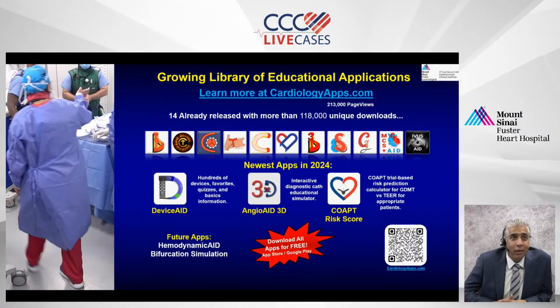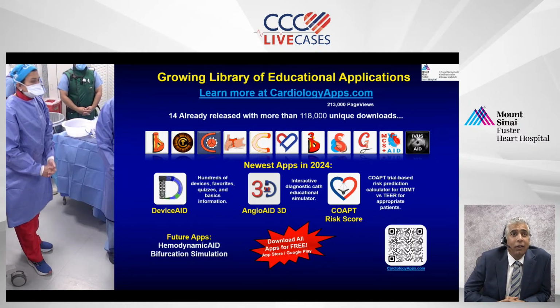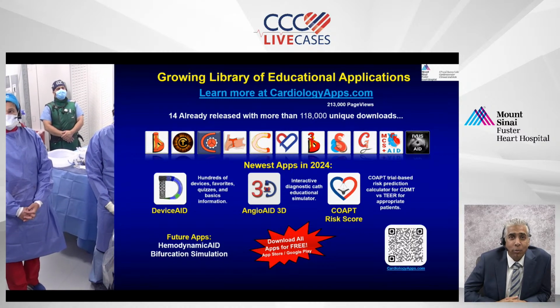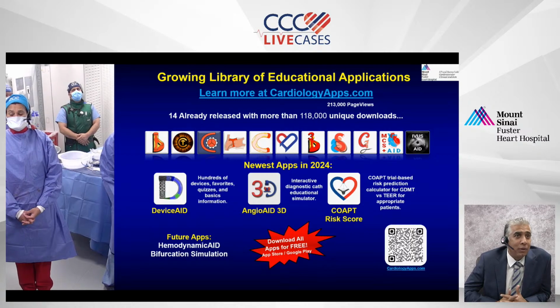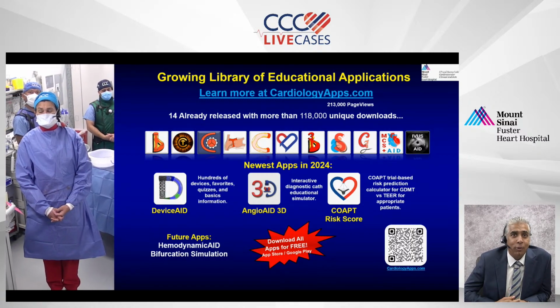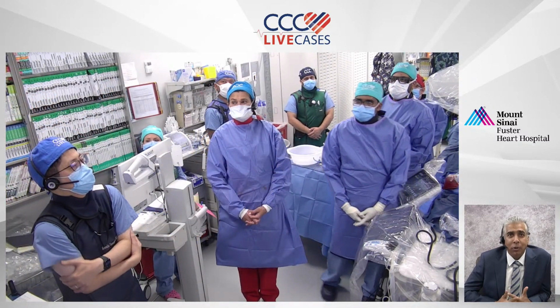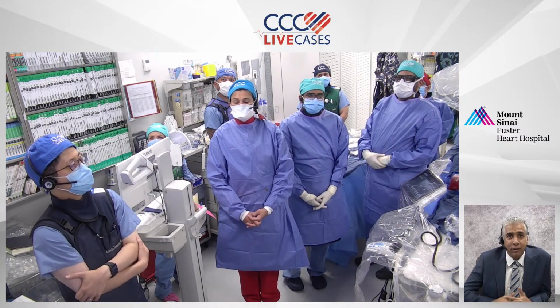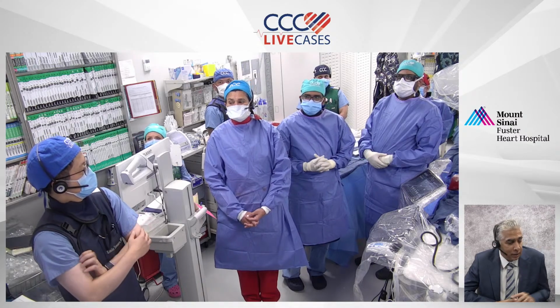Do you have anything to add? No. You summarized it really well. And it's a really good thing for everyone to learn how to do OCT. Yeah, incredibly illustrative, an instructive first OCT case. Thank you. It demystified it a lot. Just the setup. I think this was a great case to illustrate those things. And I would put a plug for the app, really to look at the images. You mentioned that. That's really the key, to understand it. I think that's what limits people a lot, is setting it up, executing it, but also understanding the images. So well done, Dr. Kinney.